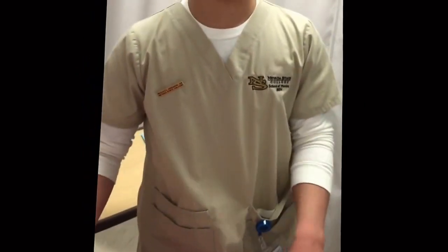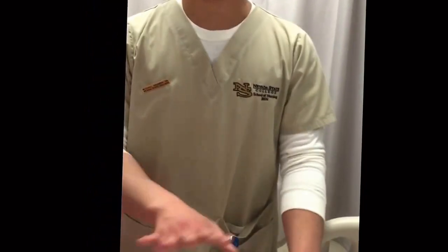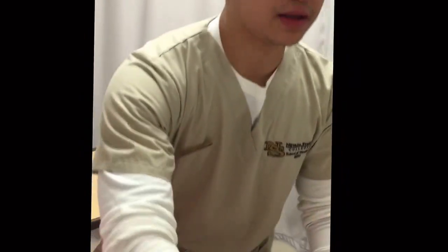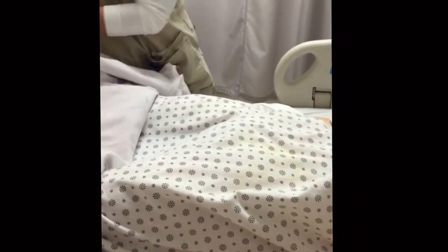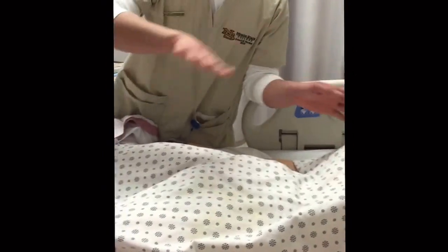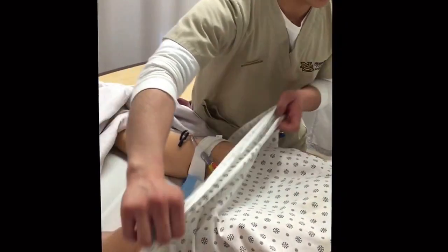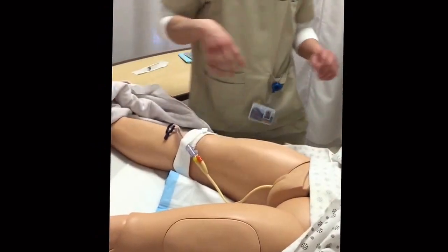Make sure you assess your patient for any pain or any discharge in her vaginal area, okay? Are you having any pain right now, Miss Susan? No. Okay, that's good. Is it okay if I expose you? Yeah. Okay. And if you have an extra blanket, just put it on top of her for her warmth and comfort, okay? So I'm gonna go ahead and lift your gown up, okay? Here we go.